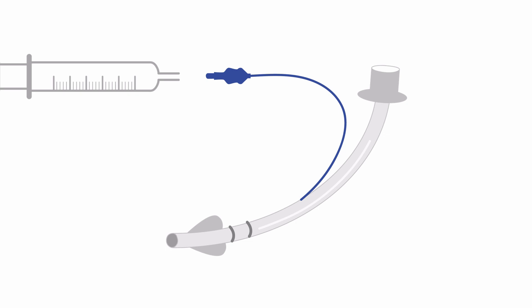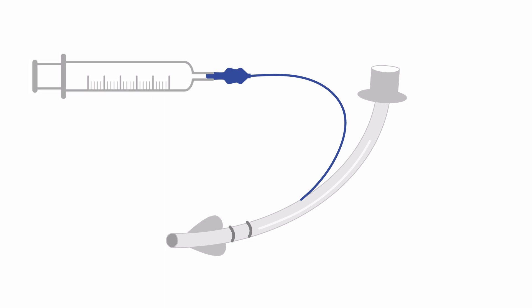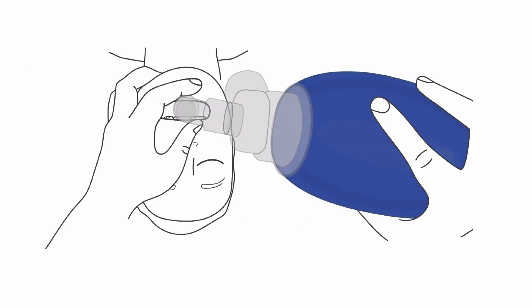Once the tube is placed, remove the stylet and attach a syringe to the balloon valve and inflate the balloon with 5 to 10 cc's of air. Now you can connect the bag and ventilate.